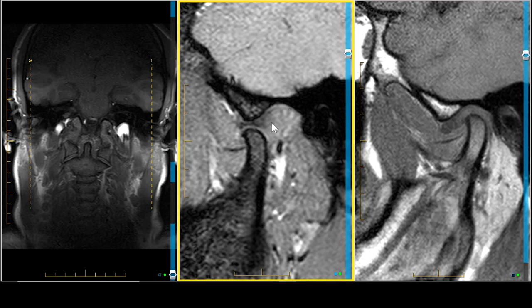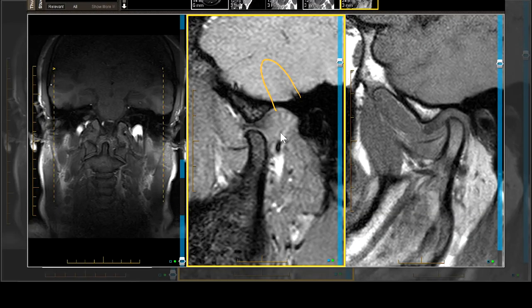It does capture and show up, but it's still a little bit ill-defined, and the upper attachment is oh so thin and barely visible. The lower attachment is off. So this patient has internal derangement — a partial internal derangement. They eventually capture and achieve this shape: the mandibular condyle forward with the bowtie at least fifty to sixty percent behind the twelve o'clock position. There is capture, therefore partial derangement, with swelling of the posterior band and swelling throughout the bilaminar zone.